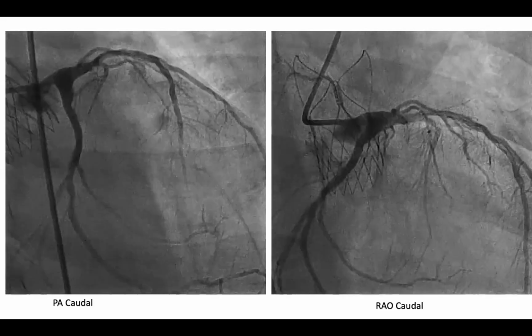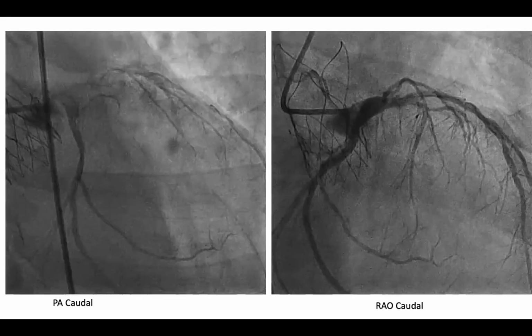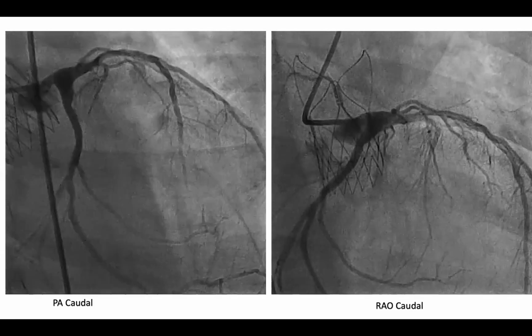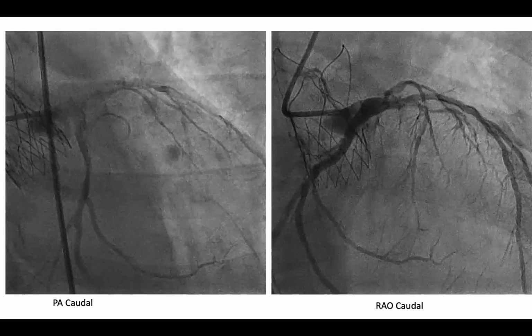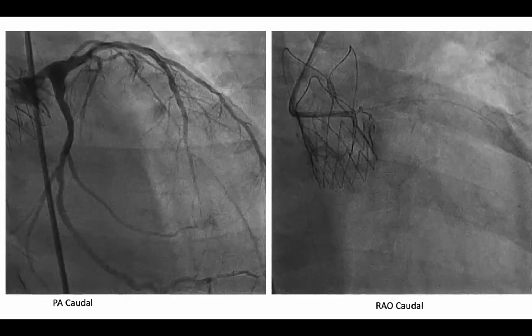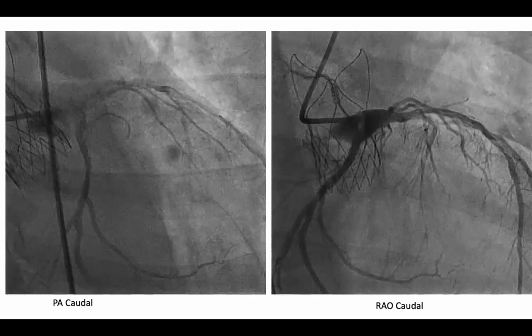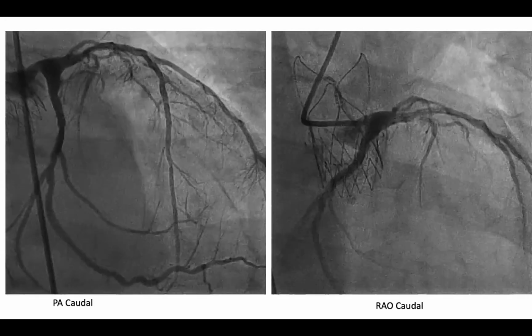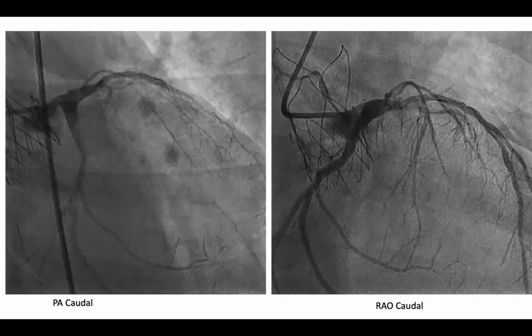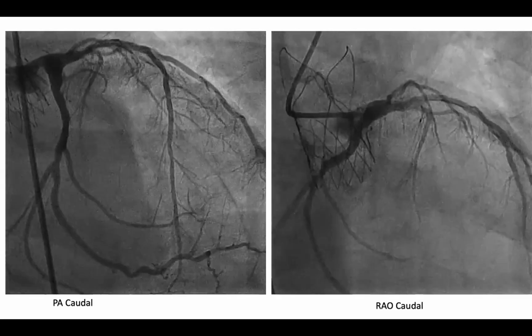If there is a TAVI valve, the femoral route is actually a preferred route. It's easier to engage into the left coronary. I did a couple of cases. The last case I did was about a month ago, and I was actually told by Dr. Kovac, they do a lot of these cases, that if you have a TAVI valve, do the angiogram via the femoral route, and you'll be able to engage the coronaries better.